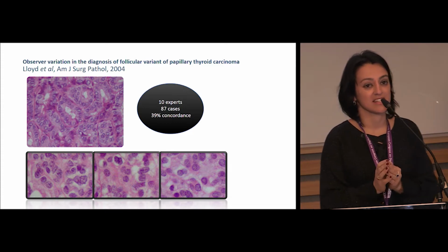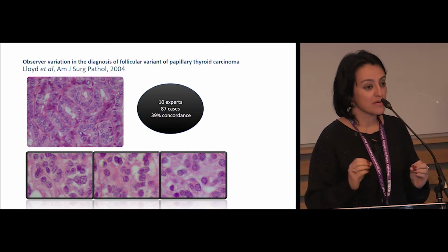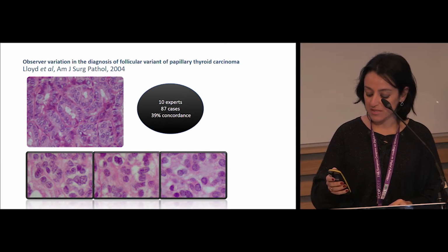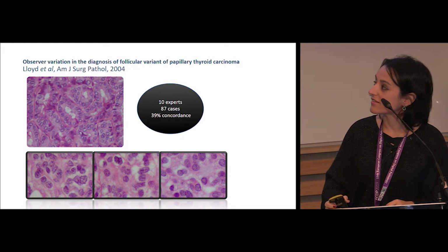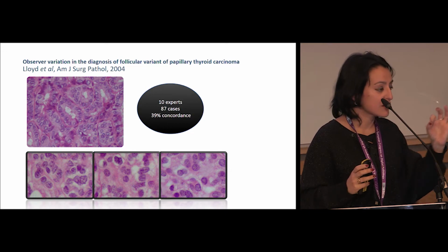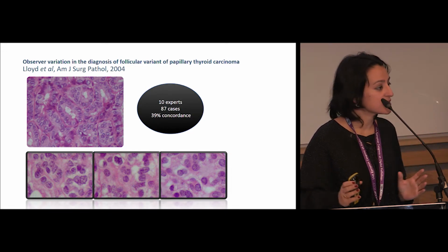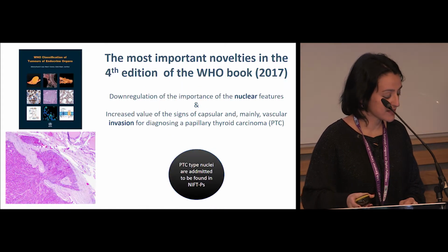So you can see this is really a model that is worthwhile to explore. If you think about these nuclei, at least pathologists probably can say that the ones on my right side are quite typical: irregular, grooved, clarified. The ones on the left are more regular, more roundish, typical of benign, but those in the middle are a mixture, and then we just don't know.